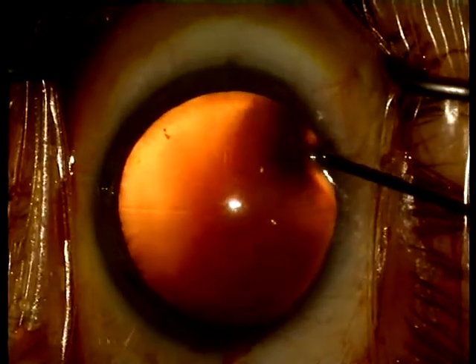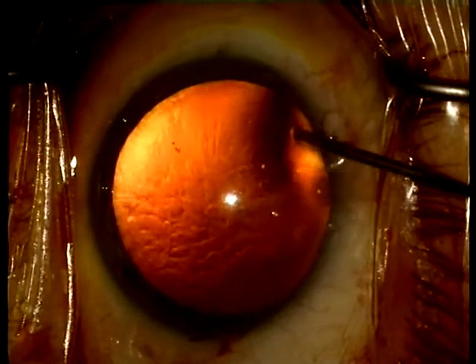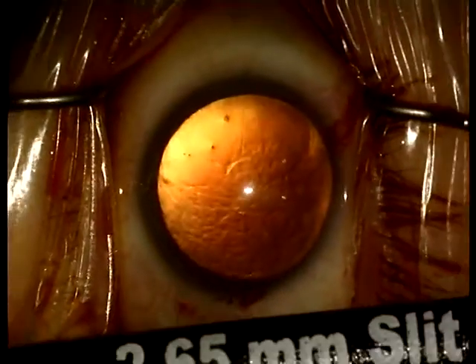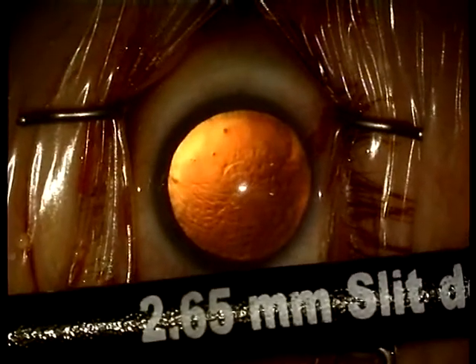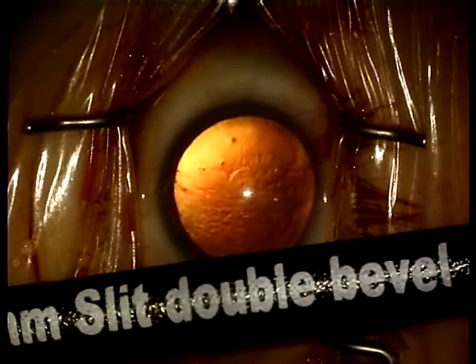Make sure that the strands of the methylcellulose are still visible, otherwise there is a risk of overfilling the chamber. The main incision is performed with a 2.65 mm double bevel knife.